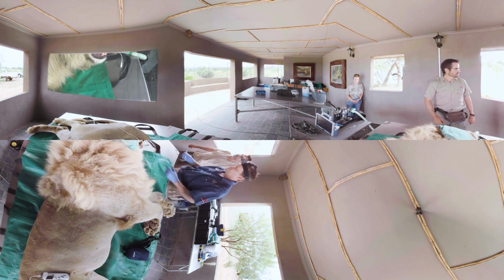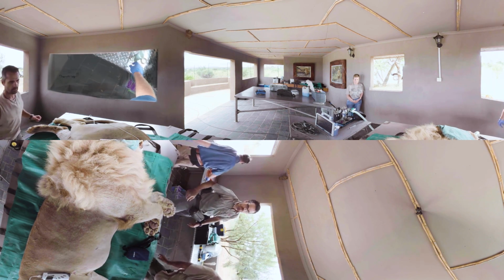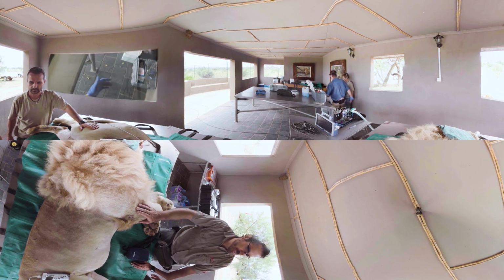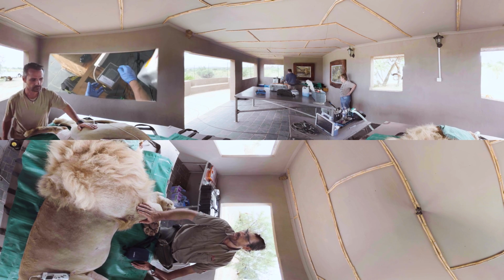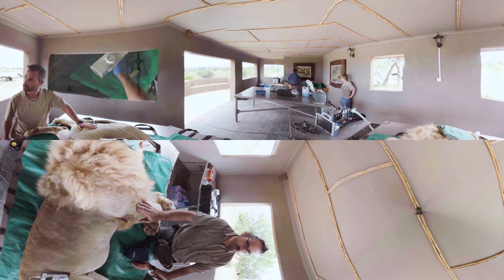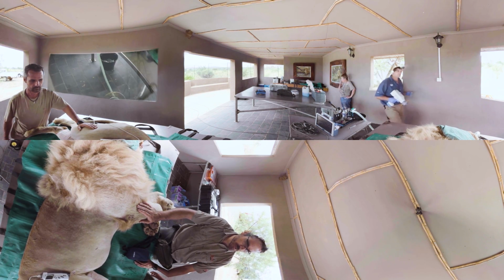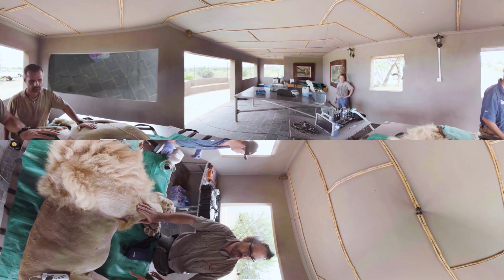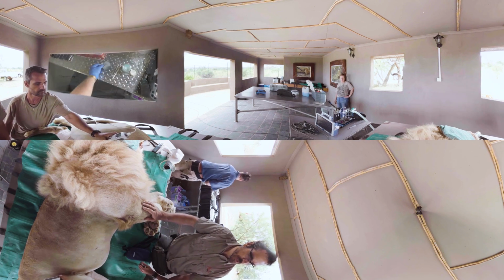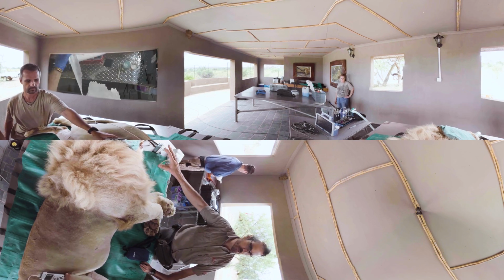While you're doing that, Adrian, come and tell us what you're looking for on your machine over here. Oh, so for him, there's obviously no work that needs to be done in his mouth, so we're not going to keep him under for very long. I've got a simplified monitoring system here. This is a pulse oximeter, which measures the oxygen saturation in his blood, and you can see that it's sitting at 100% at the moment, which is absolutely perfect. His heart rate is about 61 beats per minute, so very stable. Obviously he is on oxygen at the moment.